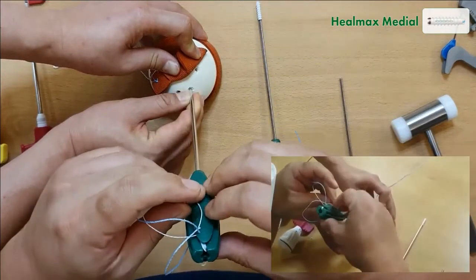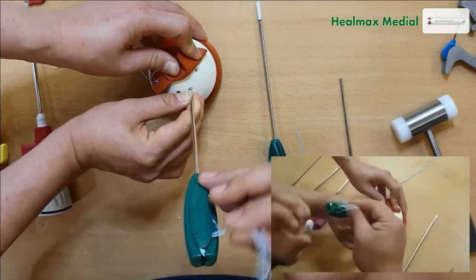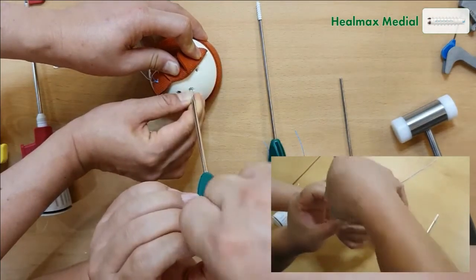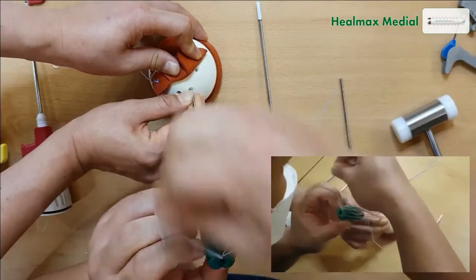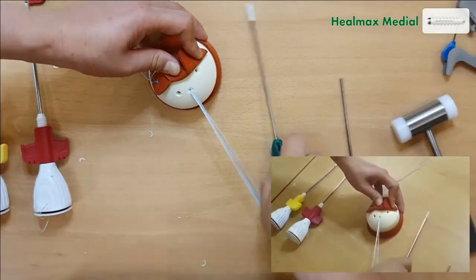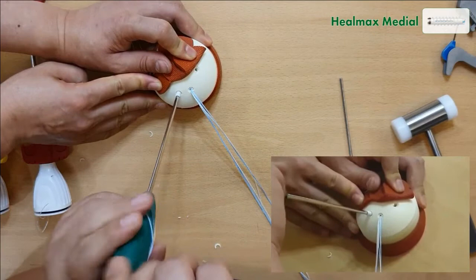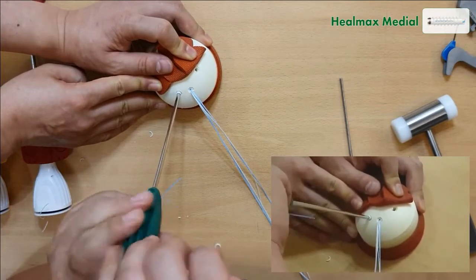We're going to remove the fiber wires from the back. This is the first one, and then we're going to go to the second one. Since you tapped it, it goes in very smoothly.